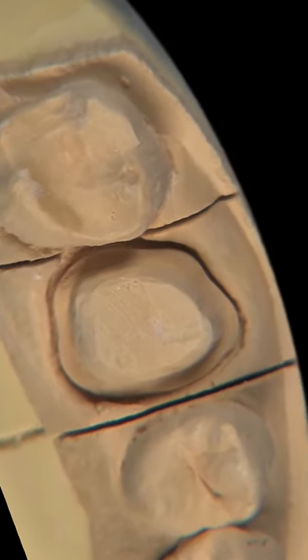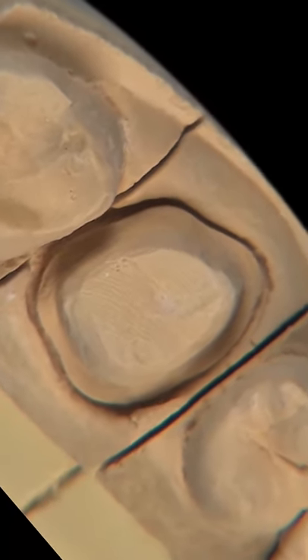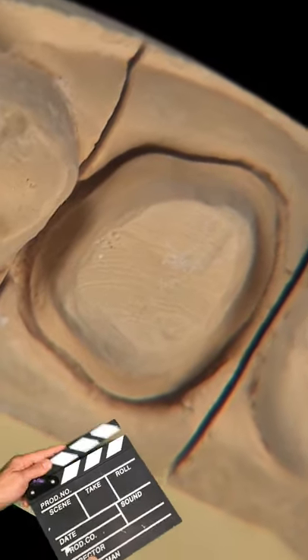This universal prep is fantastic. This is exactly what I like to show dental students as the ideal preparation.